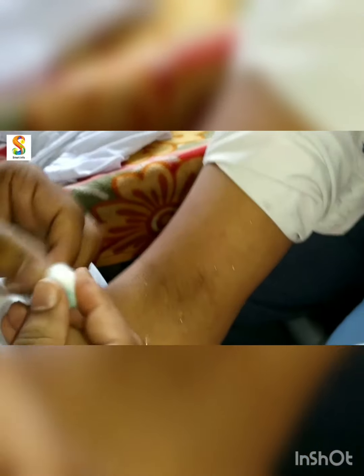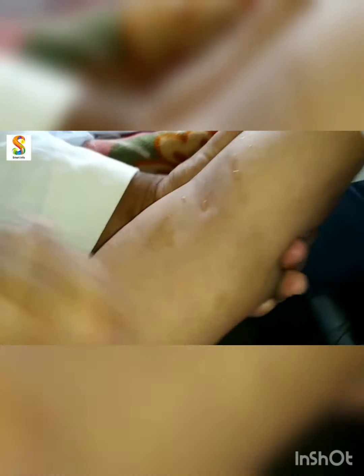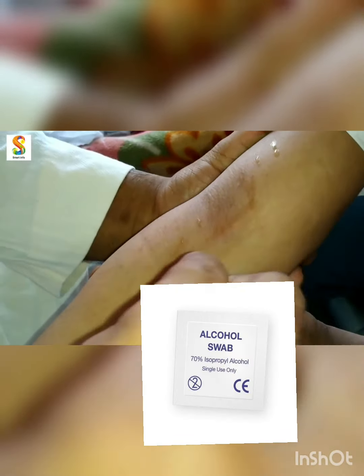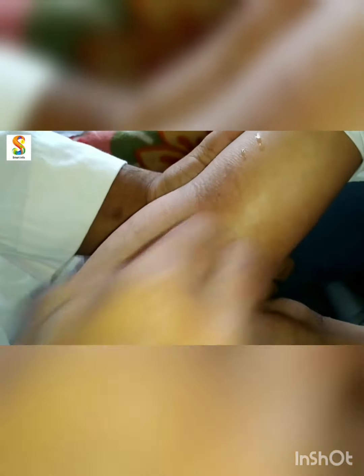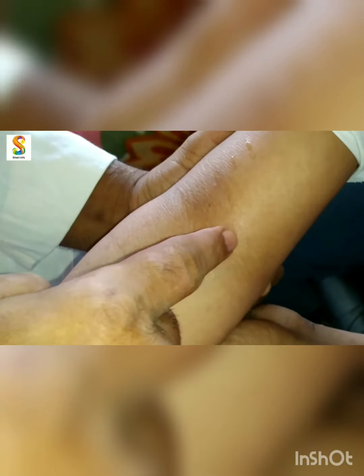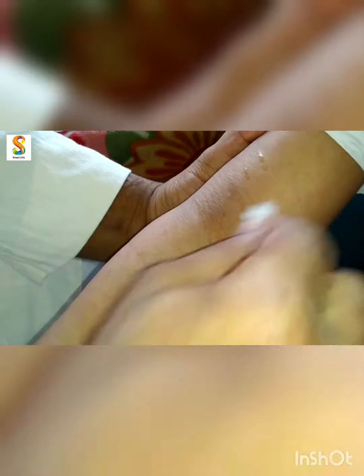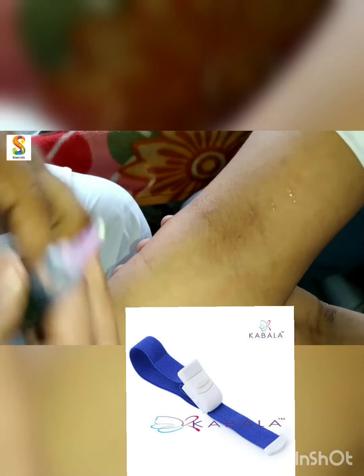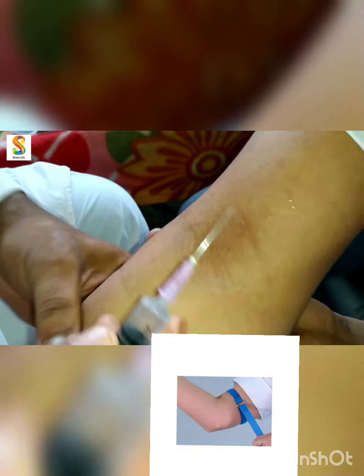Then we need to clean the surface with the help of an alcohol swab. That's usually an antibacterial alcohol swab, and we should let it dry. We should not use anything; we should let it dry by itself. Here you can see there is a vein that's very prominent. If a person does not have a prominent vein there, we can use a band that's called a tourniquet. But this person has a vein that is very prominent here.